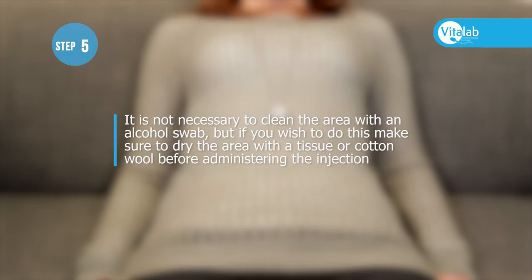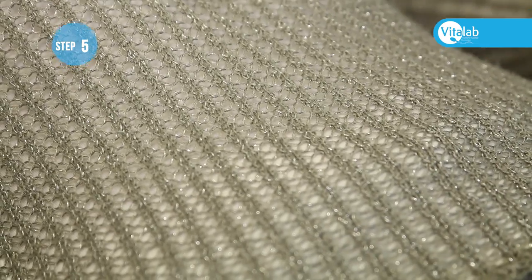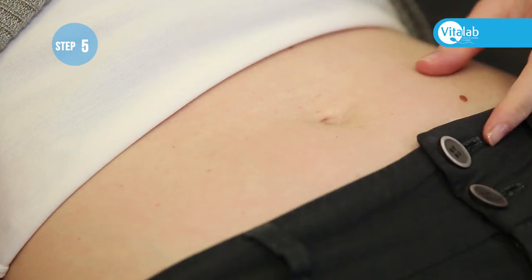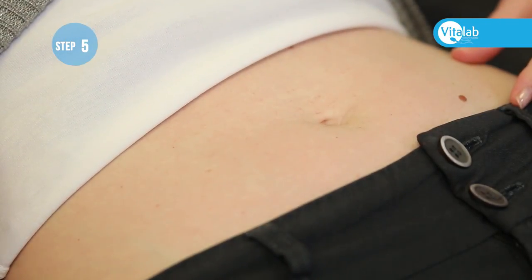But if you wish to do this, make sure to dry the area with a tissue or cotton wool before administering the injection. The injection can be administered anywhere in the abdomen, in this area below the belly button.